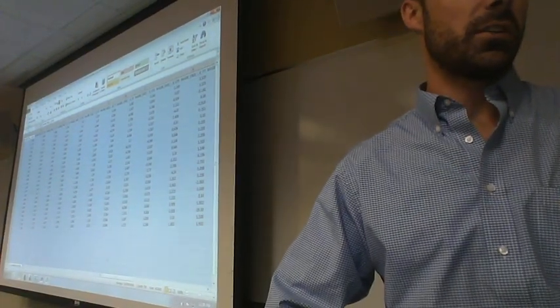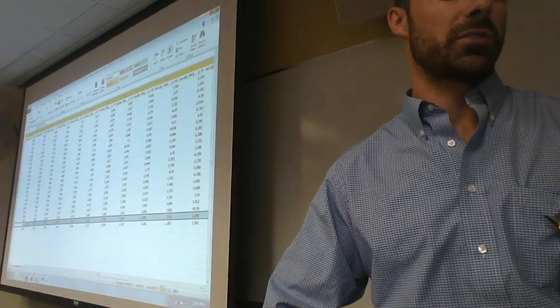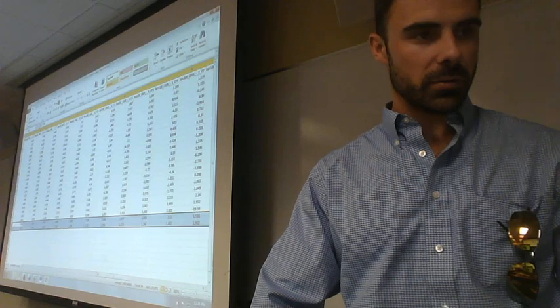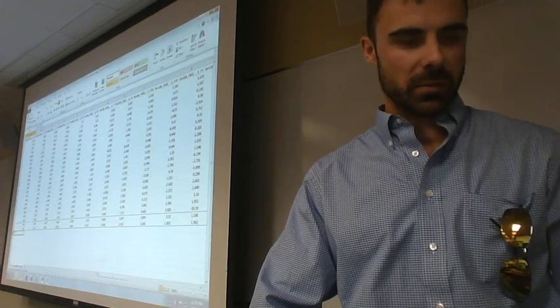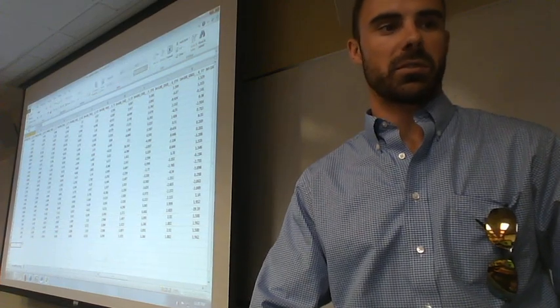All right? Now, I think I have our spreadsheet set up for 25 subjects, and this right now is set up for 23. So what I'm going to do is create some pseudo subjects. I'll copy 2 of those there. We'll paste them down there. It's perfectly fine for illustrative purposes at this point.